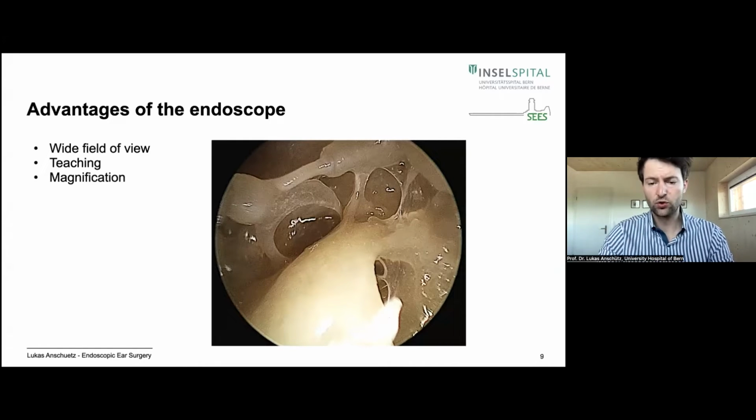You can have a very good magnification with the endoscope because you can go as close as you want to the structures. So you can see here the stapes, and the pyramidal eminence with the tendon. You can actually see how the tendon comes out of the bone. We can see the sinus tympani, and if you look here, this is the ponticulus. This is a small bony crest from the pyramidal eminence to the promontory, and you can see it's a small bridge. So below there is no bone.